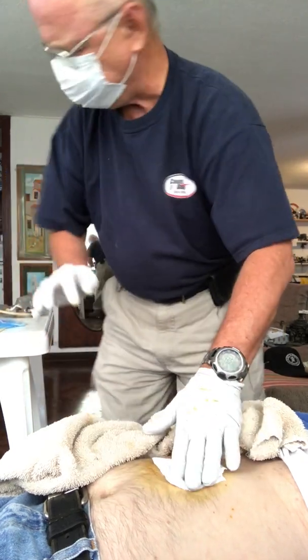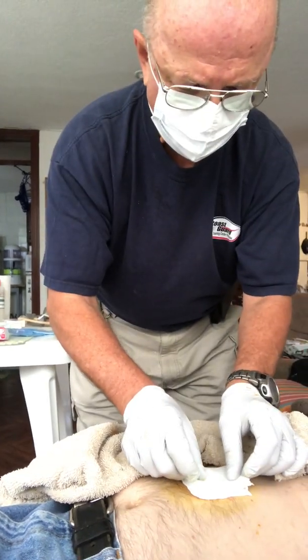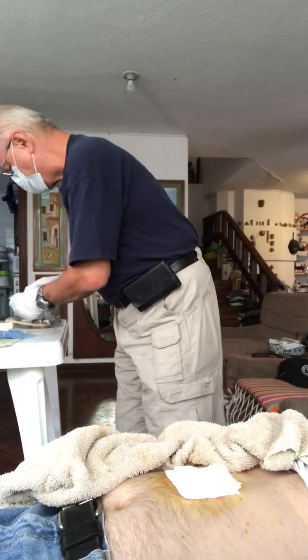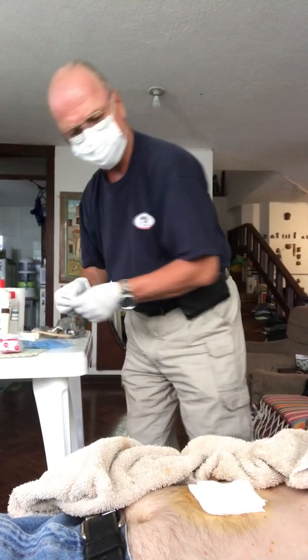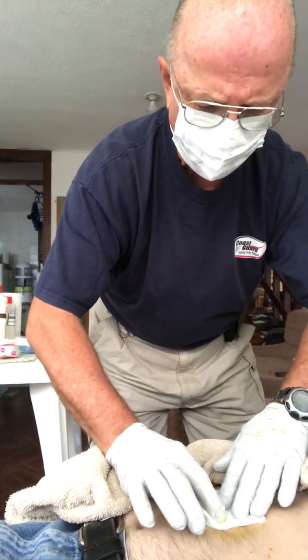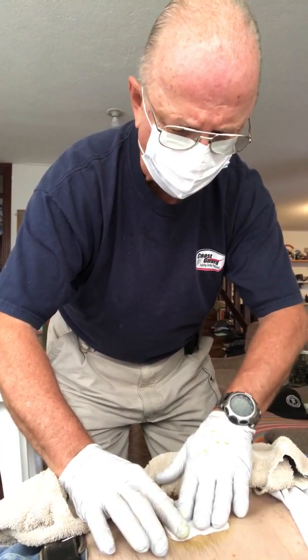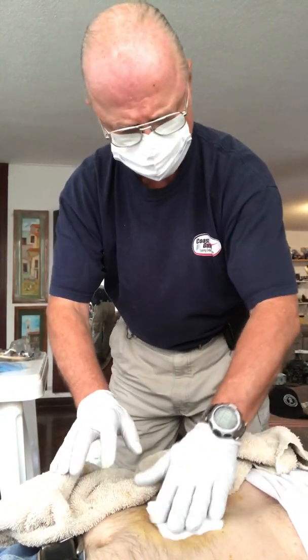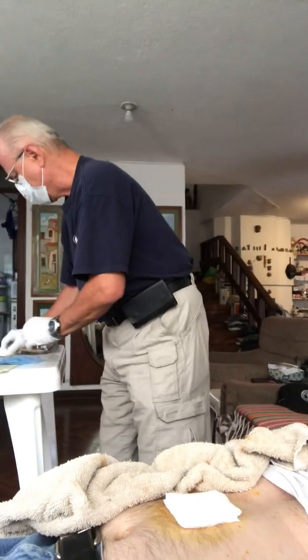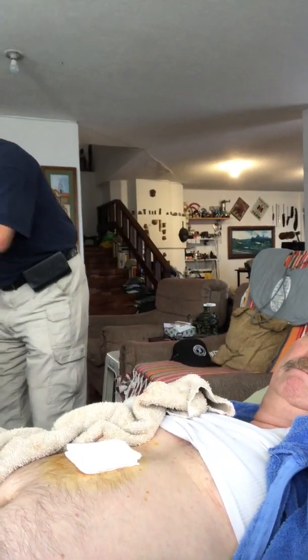So I'm going to put three or four on there. Like that. Maybe one more, because the most bleeding occurs right after the procedure. So right now is when you're going to have it. This should hold you off for the next 24 hours. It may bleed through a little bit, but hopefully not if you don't move too much. Keep it easy, don't be walking around too much. Don't be stressing out too much. Keep your stomach muscles relaxed. Don't tense them, okay?